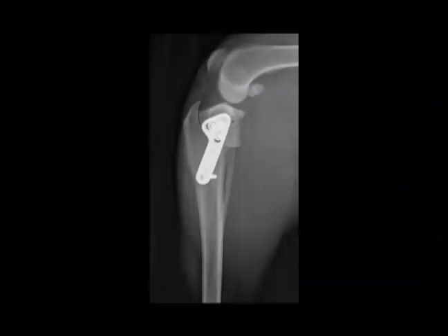Here's an example x-ray of a level tibial plateau — we actually shoot for about five degrees — with the bone plate in place. Our patients go home the day of surgery, usually about two hours after surgery. The night of surgery they're very comfortable because of the epidural, but they're very sleepy. Most go home, find their favorite spot, and sleep through the night. A typical lab may want half a dinner before bed.